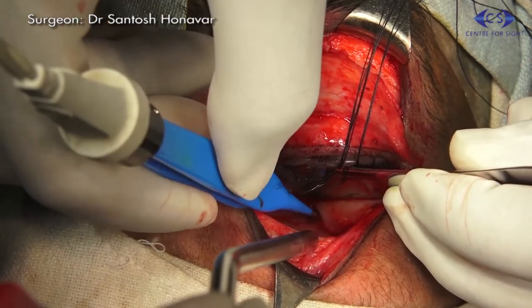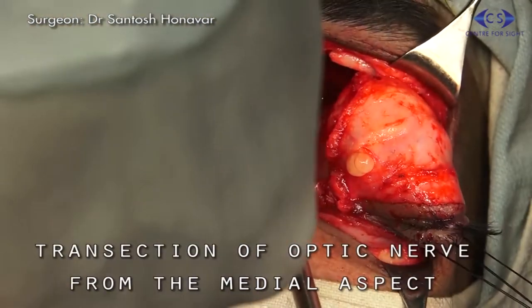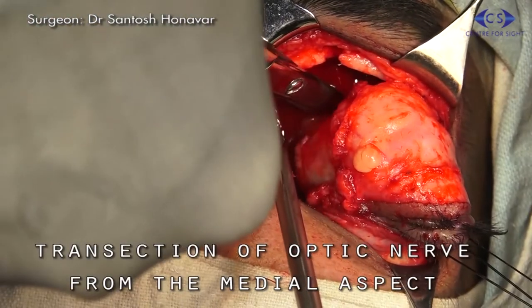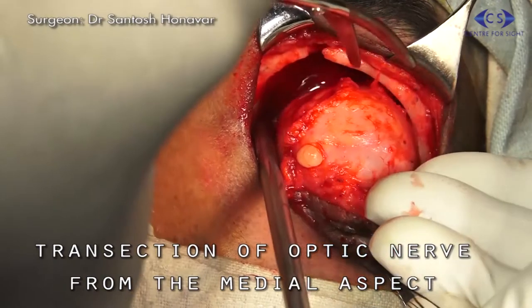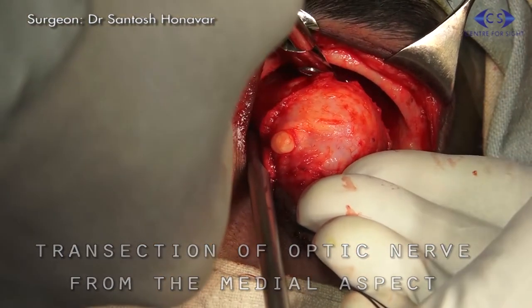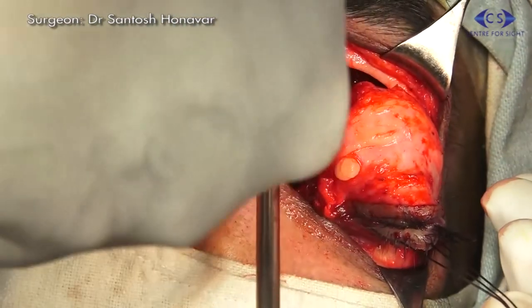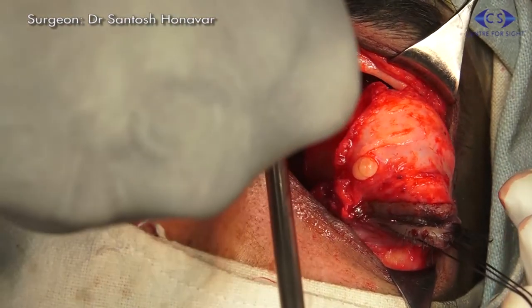A pair of curved enucleation scissors is then introduced into the posterior orbit. The optic nerve, superior orbital fissure contents, and posterior orbital tissues are cut.